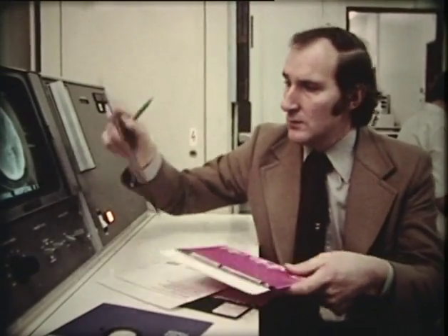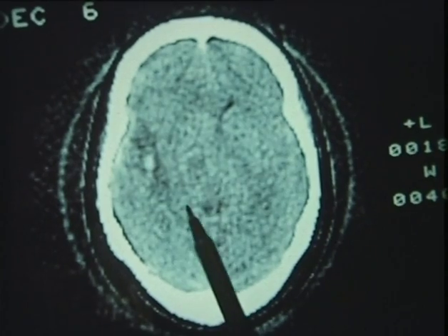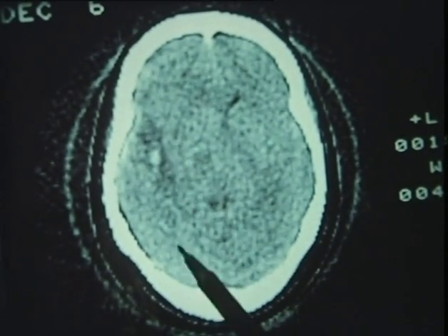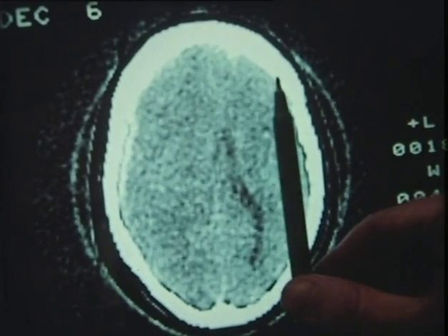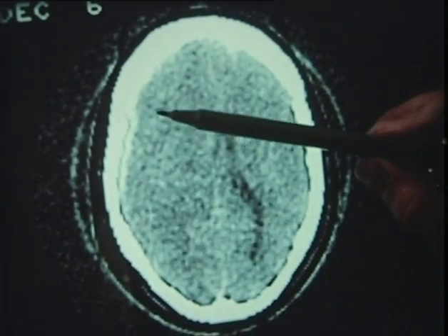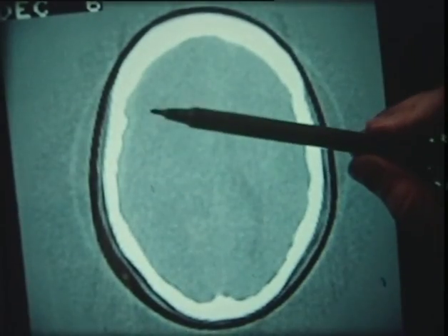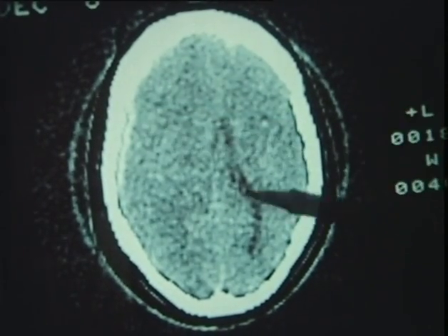This is a girl who, after a party, was beaten up by her boyfriend. And here on the left side is the area of contusion, which is seen as an area of low density with little spots of blood within it. And on the next cut, you can see the ventricles once again displaced away from the side of the abnormality, and some blood here which is less dense than the skull, lying between the brain and the skull.